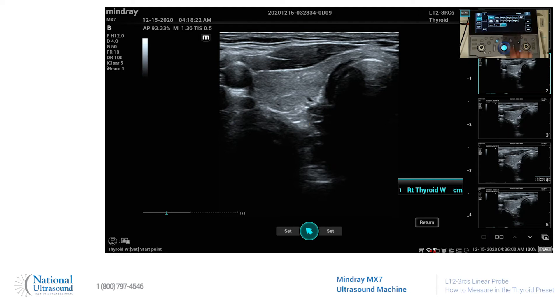We'll go ahead and do the thyroid width. Your set buttons are on either side of the trackball. And then we'll go ahead and hit height. And then we can save that.